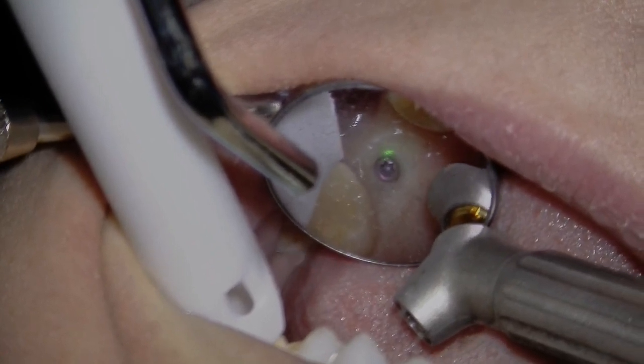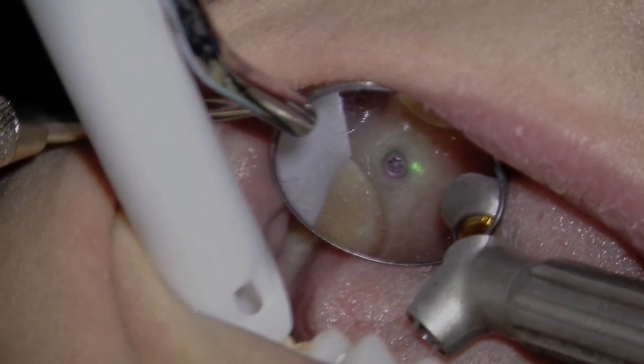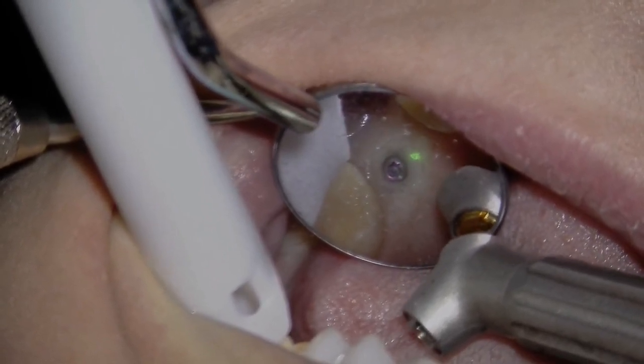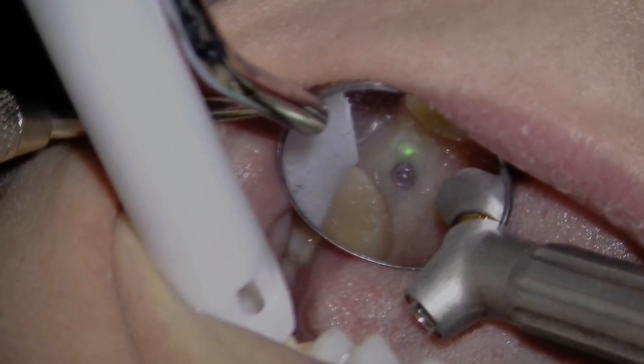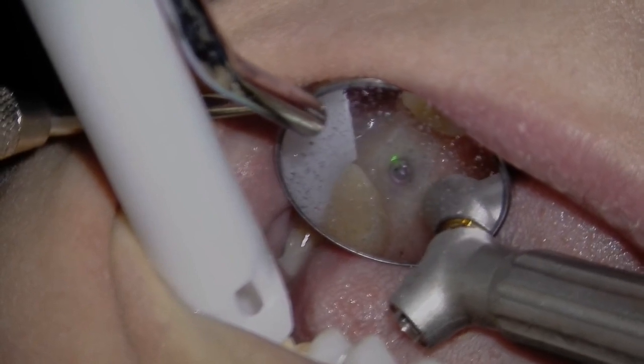The patient had no post-op soreness or sensitivity, thus the dentist was able to make the final impression the same day. Total chair time was 23 minutes. This case demonstrates Solea's precision and the clean tissue removal, allowing control of contours and immediate restoration.